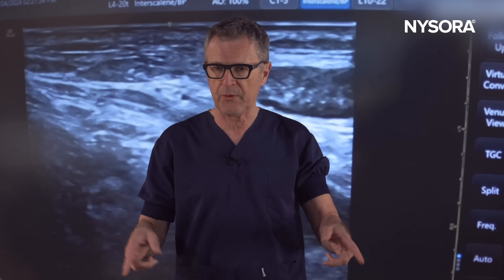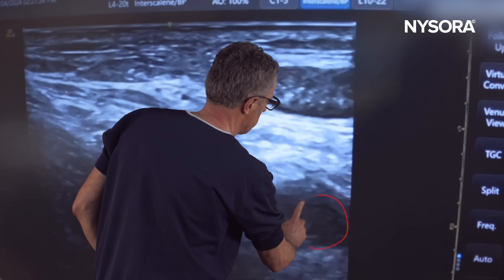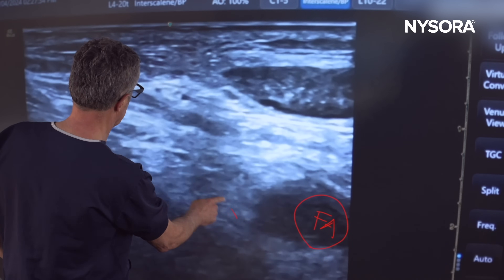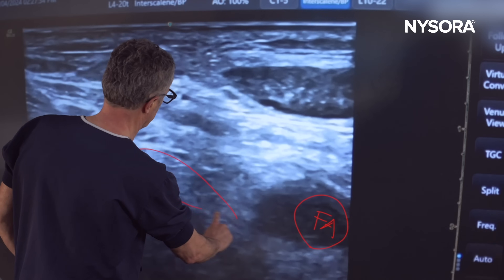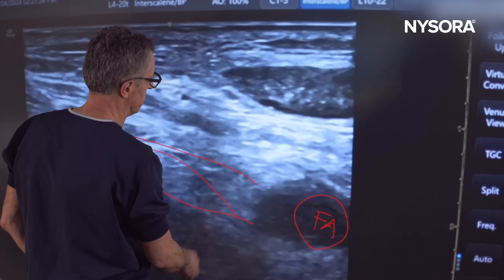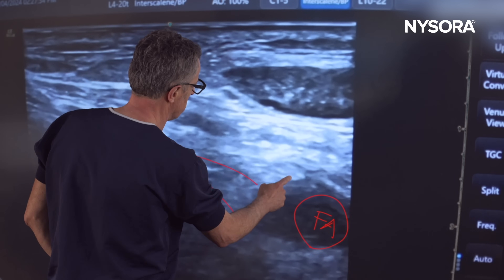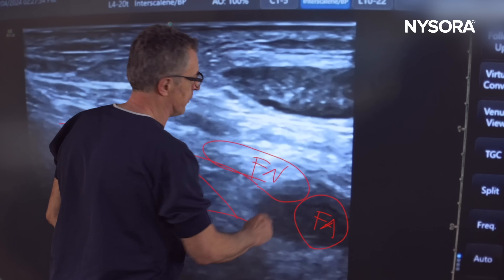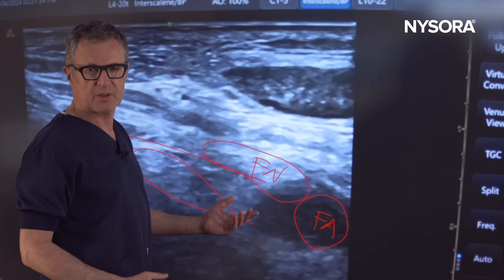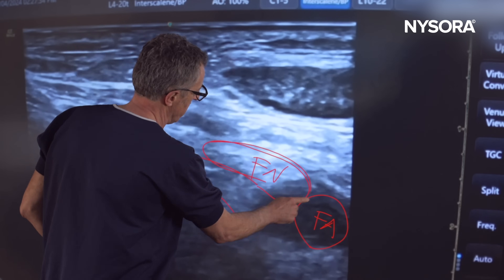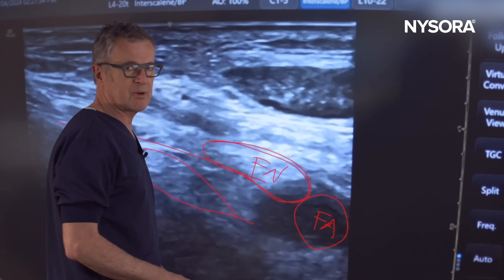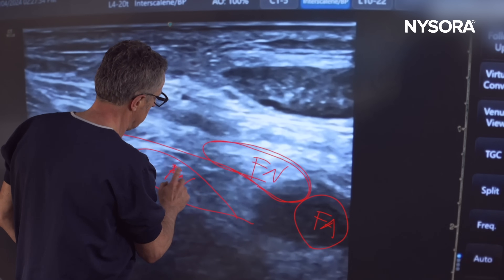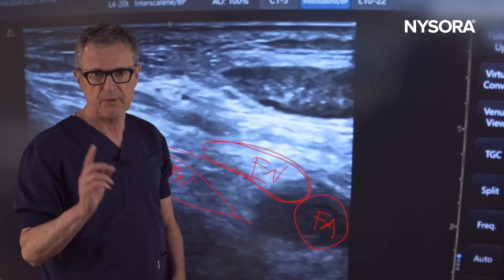Let's briefly review the femoral anatomy. That's the femoral artery, and here is the femoral nerve. The fascia is over the nerve. Oftentimes practitioners make a mistake identifying the femoral nerve, mistaking it for a fat pad lateral to the femoral artery. But that is the femoral nerve — keep that in mind as we go through the video.